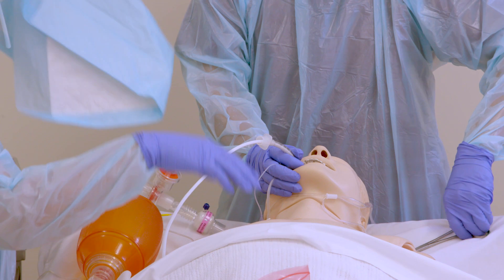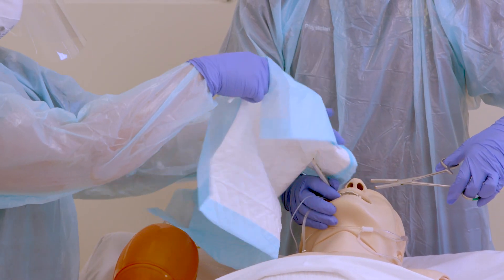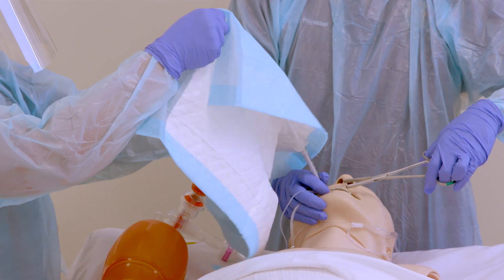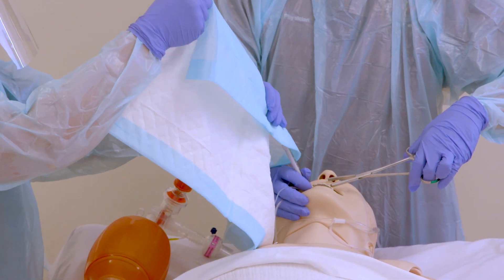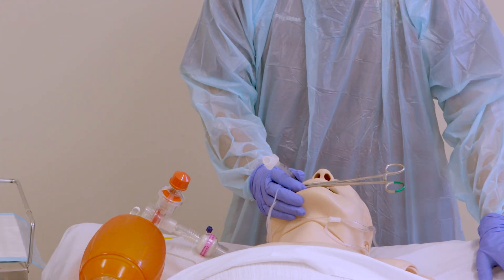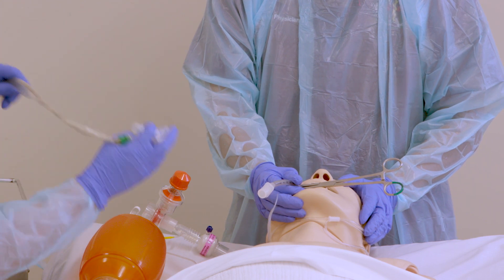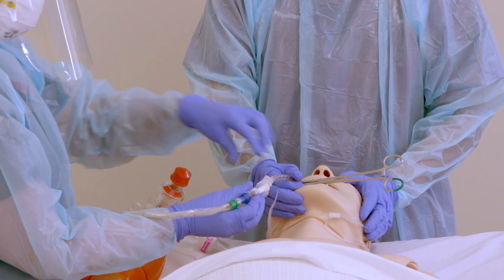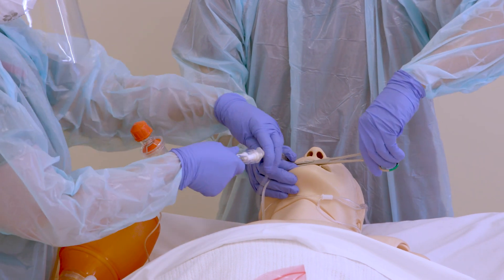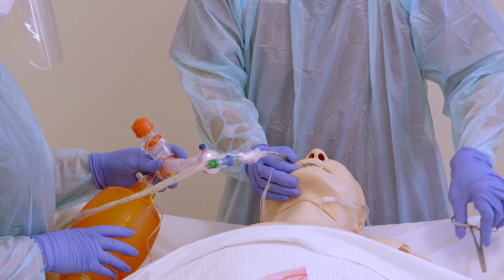Use a bluey to grab the bougie and remove it. Clamp the ET tube as the bougie is being removed. Place the bougie into the biohazard bag. Attach the inline suction catheter.